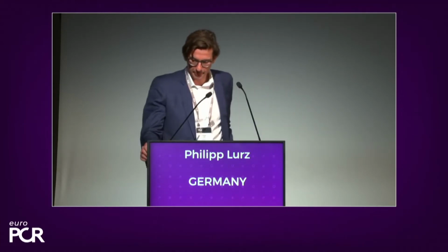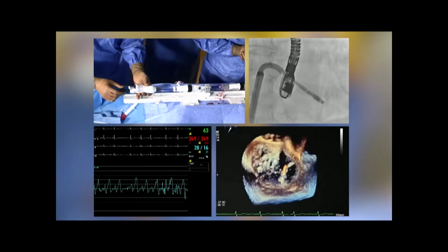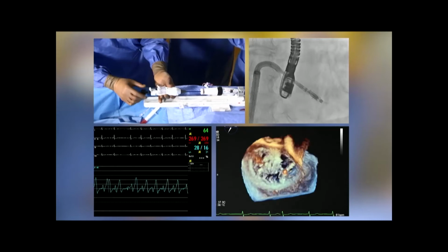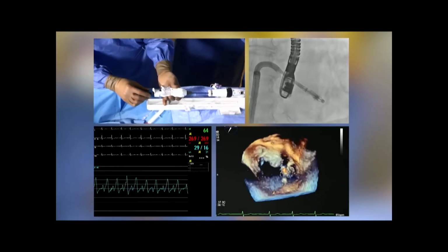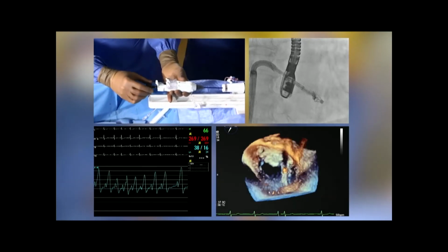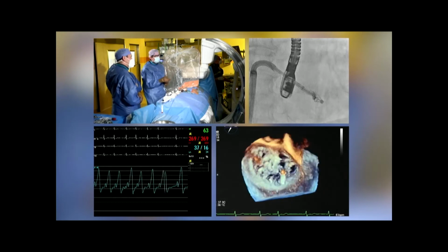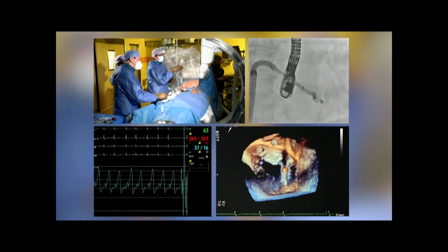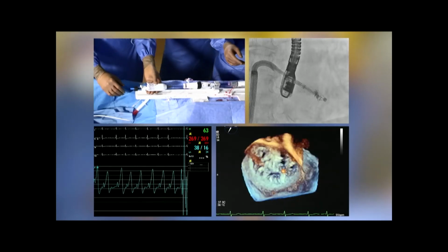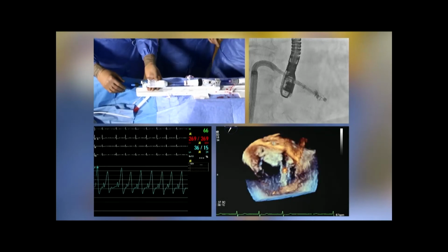So if we turn a little bit more counterclockwise, we are respecting more the line of coaptation, and we're more perpendicular to the line of coaptation in this very medial commissural part of the mitral valve. Okay. Now we can appreciate that the clocking is much more 12/6 o'clock than we wanted it to be. So, yes. And again, it makes the point, some things you can appreciate better once you open the device. Pressures go up now again. That's to be expected. Yeah.